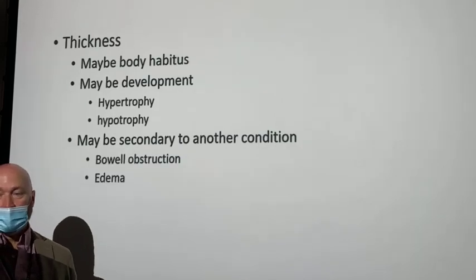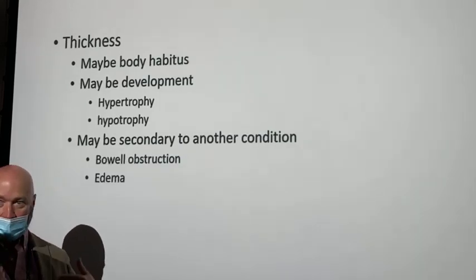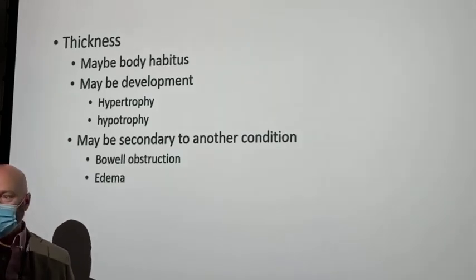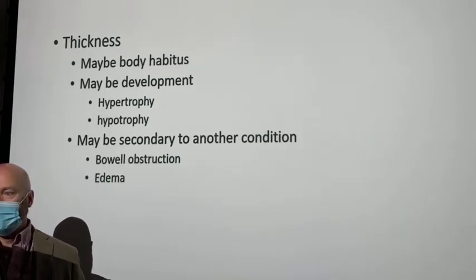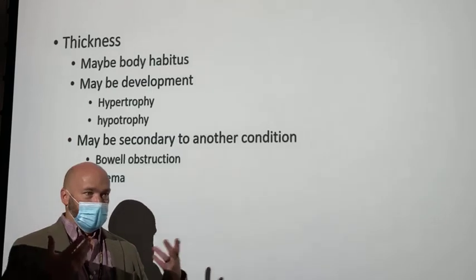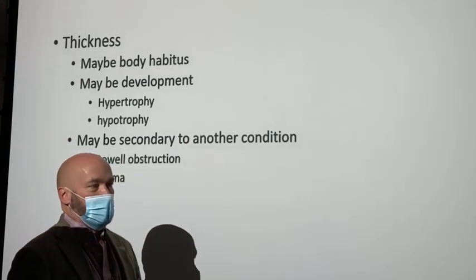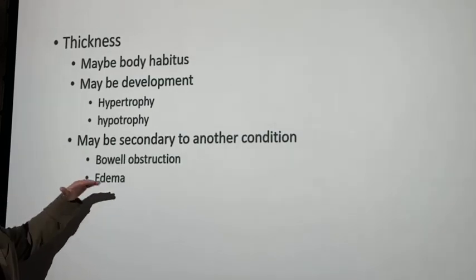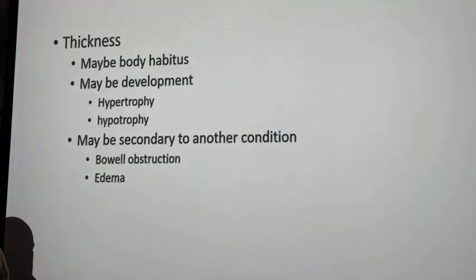If it's full of bile, that means that the bile that they create and expel into the small intestine is just not going anywhere. So they're sucking it back out, and it's in the suction canister. So you walk into the patient's room, you take a look at these things, you evaluate your patient.